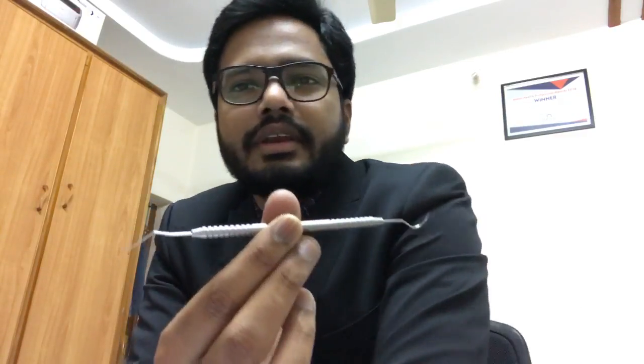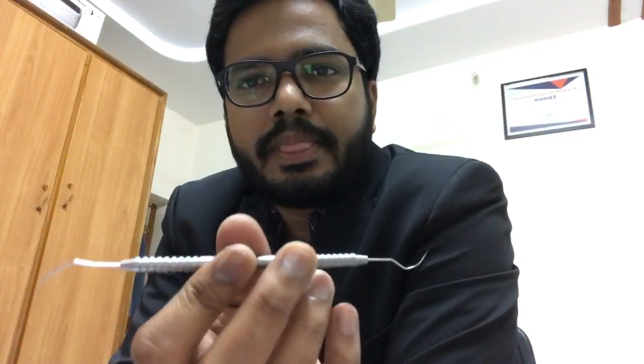It's given in literature saying that it can be used for carving, but not in Sturdivant, I reckon. In Sturdivant, it's not given. In one book of preclinical manuals, it's mentioned.